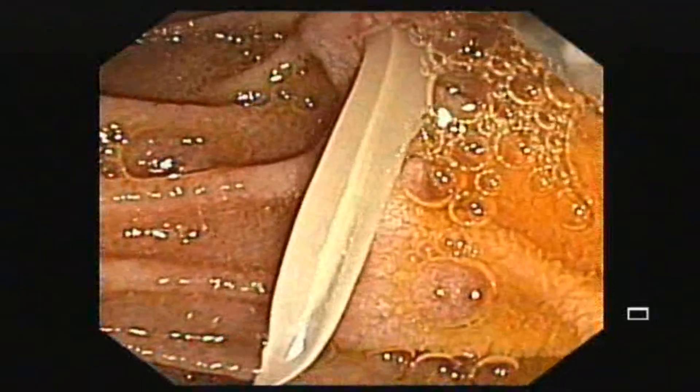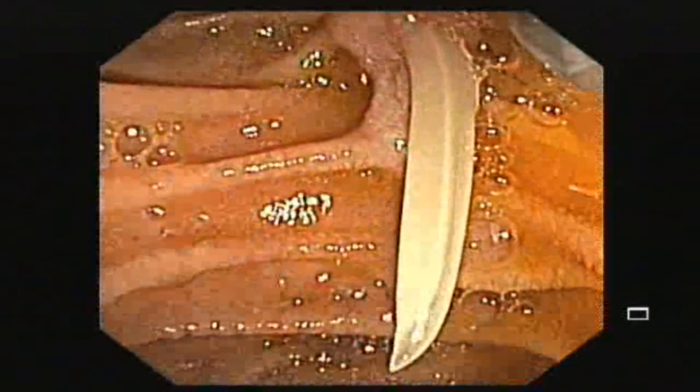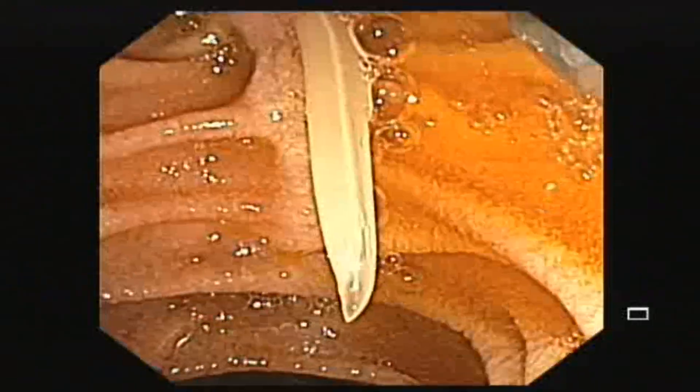The patient was taken for an ERCP procedure to take out the worm and to clear the common bile duct. Sometimes these worms can be found in multiples.